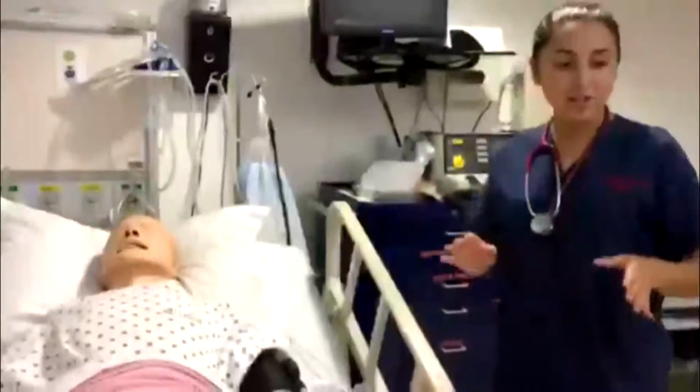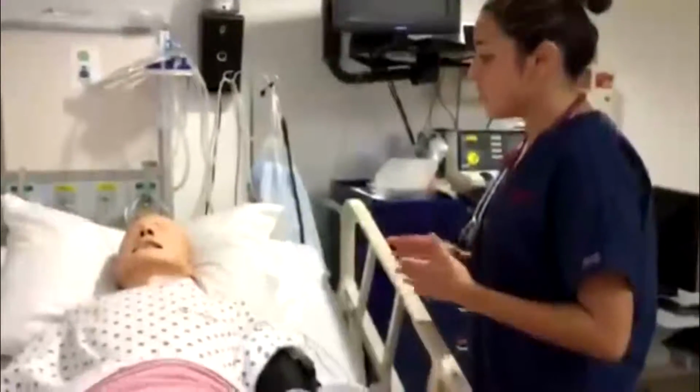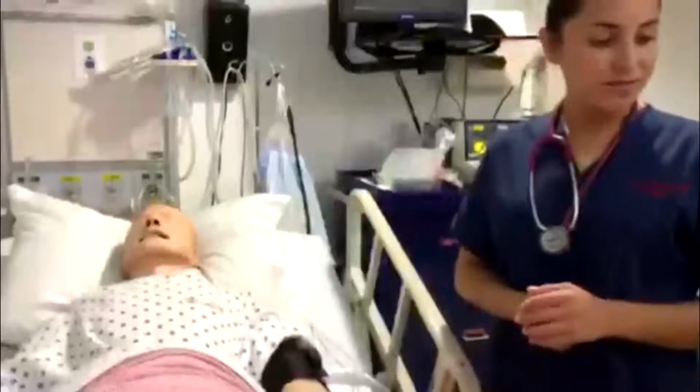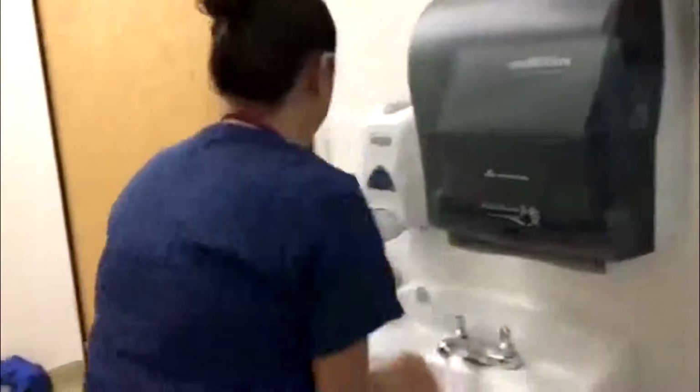Before I continue, do you have any allergies to medications or latex that I should know about? I think I have an allergy to sulfur and shellfish. Okay, great. That's good to know. Thank you so much, Mr. Sweetheart. I'm going to go ahead and wash my hands and then proceed really quickly. It won't take too long, okay? Okay.